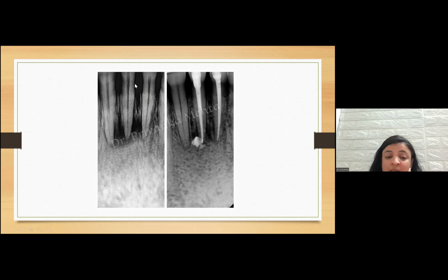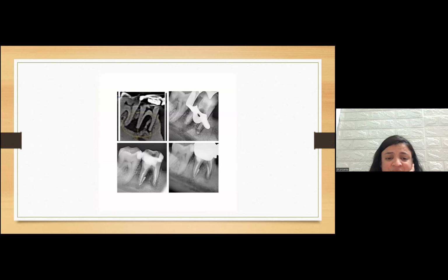Here, I had given calcium hydroxide and triple antibiotic paste, both dressings, for 15 days. I cleaned, disinfected, and after a month, there was no drainage coming out. So I just obturated it with a bioceramic sealer and GP points. Okay, so this was the case where I was also not having much hope here. I thought it would fail, but the patient insisted on saving the tooth.